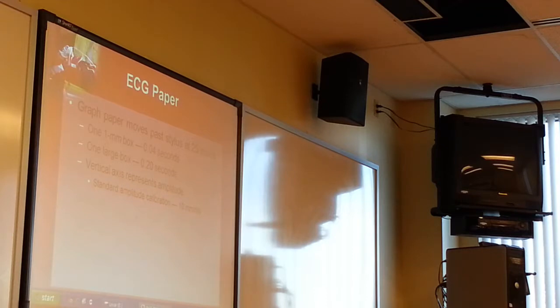Okay, so the vertical axis represents amplitude. Standard amplitude calibration is 10 millimeters per millivolt.